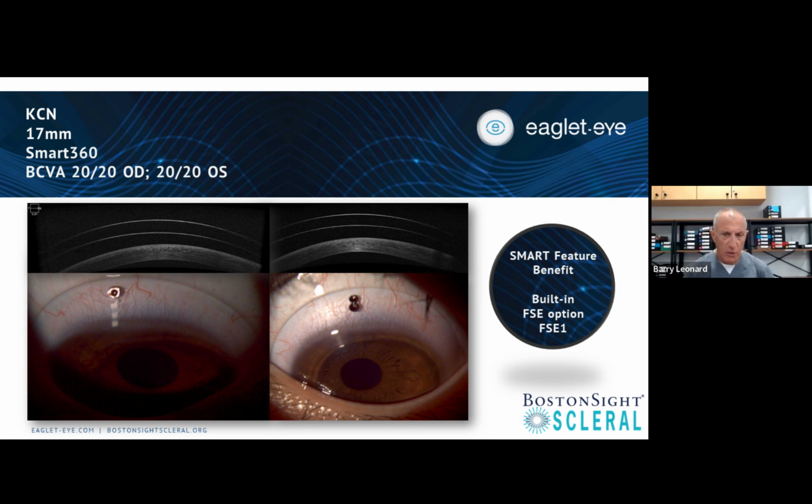All these lenses, when we submit the data through the FitConnect, we're really developing this oval optic zone using the HVID and VVID. And as we know, that's going to help us align with the limbus and keep these lenses centered. Because of that drop that we all want to get rid of, with lids pushing things down and gravity pushing things down, we can really eliminate that.